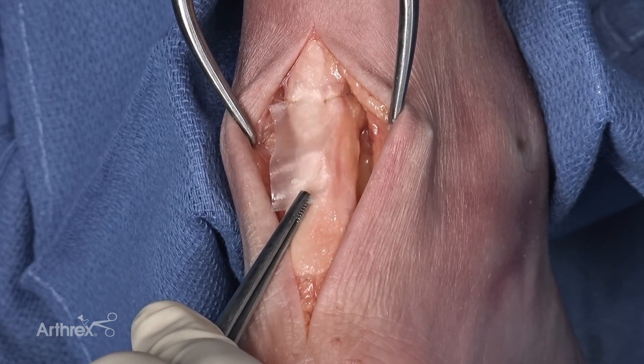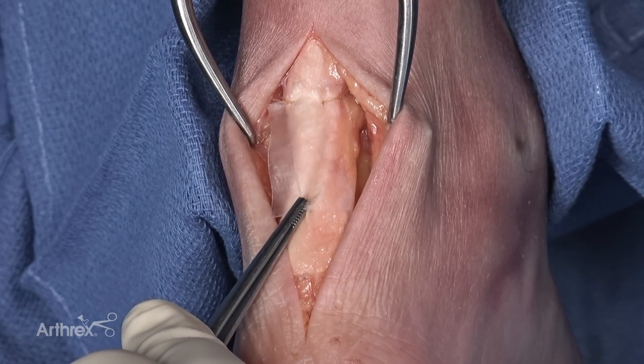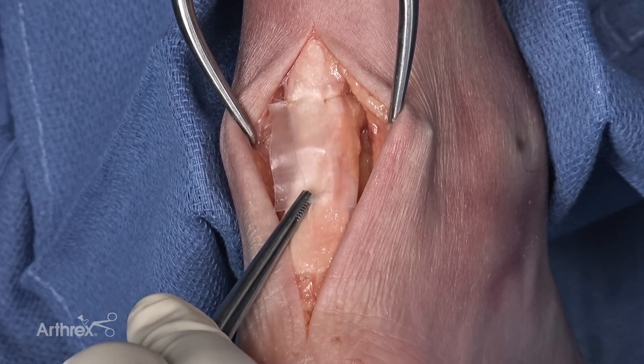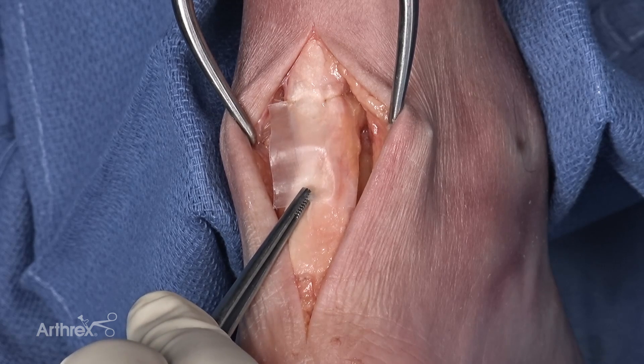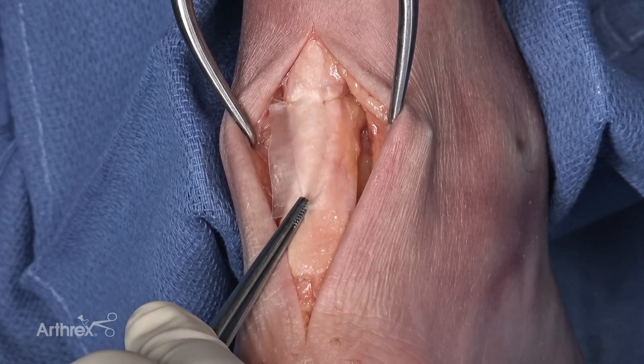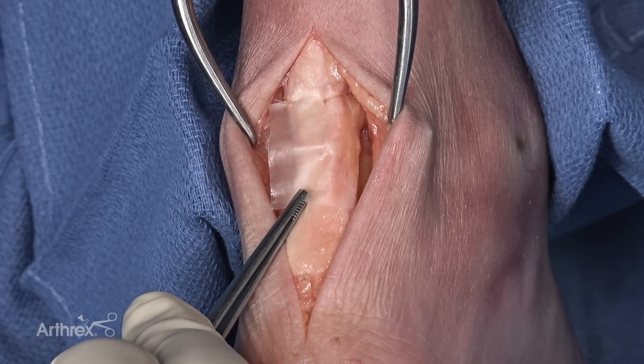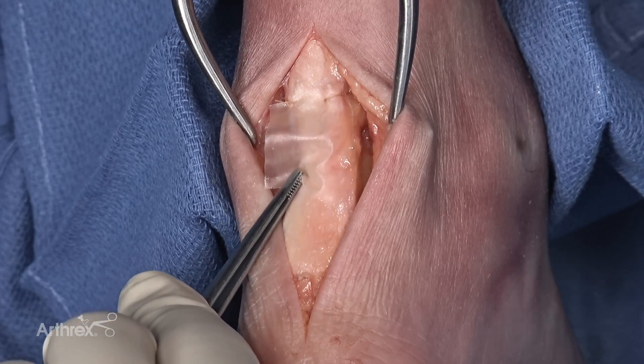We do not want to simply place four simple interrupted sutures around the scaffold, because if you get movement, you'll get subdermal friction, and subdermal friction will ultimately lead to wound dehiscence and ultimately the body trying to eliminate the scaffold. At the end of this repair, this scaffold will be completely amalgamated with the tendon, and the units will work essentially as one consistent structure.